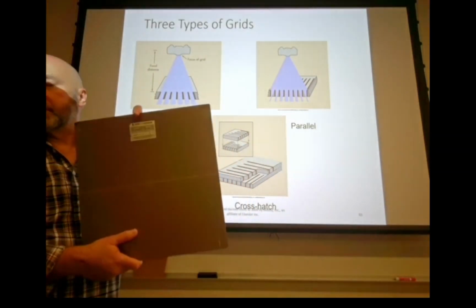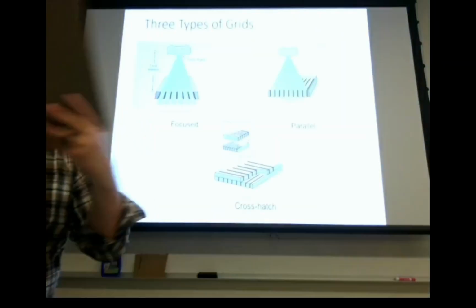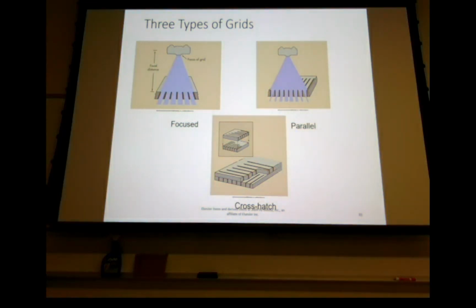Okay, so it's got a lot of very specific and particular instructions on it. So let's kind of compare those two. I got another one up here, but there's nothing really remarkable about it. It's pretty self-explanatory. It kind of latches on, so you know which side is tube side, which side is not. So I'm not gonna pass it around.